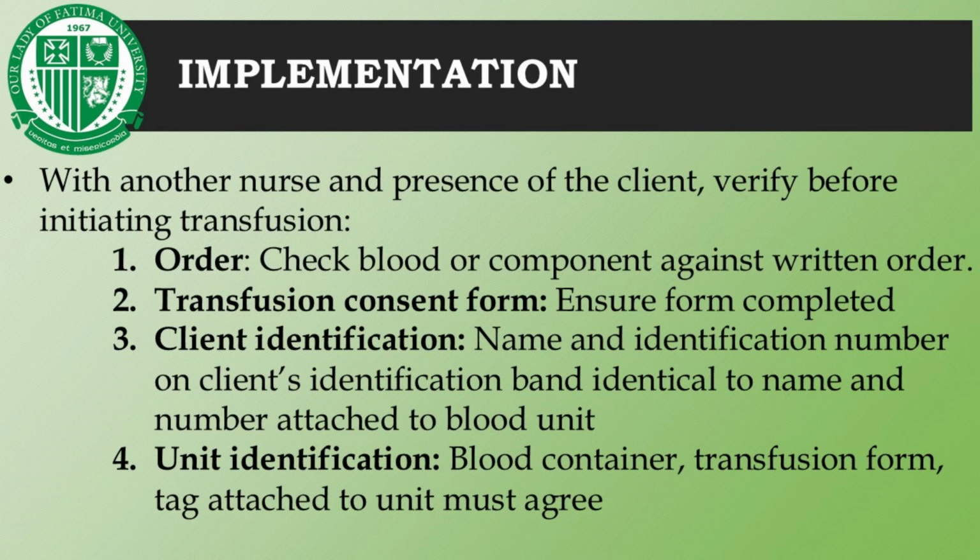Remember that, with another nurse and in the presence of the client, verify before initiating the transfusion. In the doctor's order, check the blood or components against the written order. In the transfusion consent form, ensure the form was completed by the patient. In client identification, the name and identification number on the client's identification band are identical to the name and number attached to the blood unit.